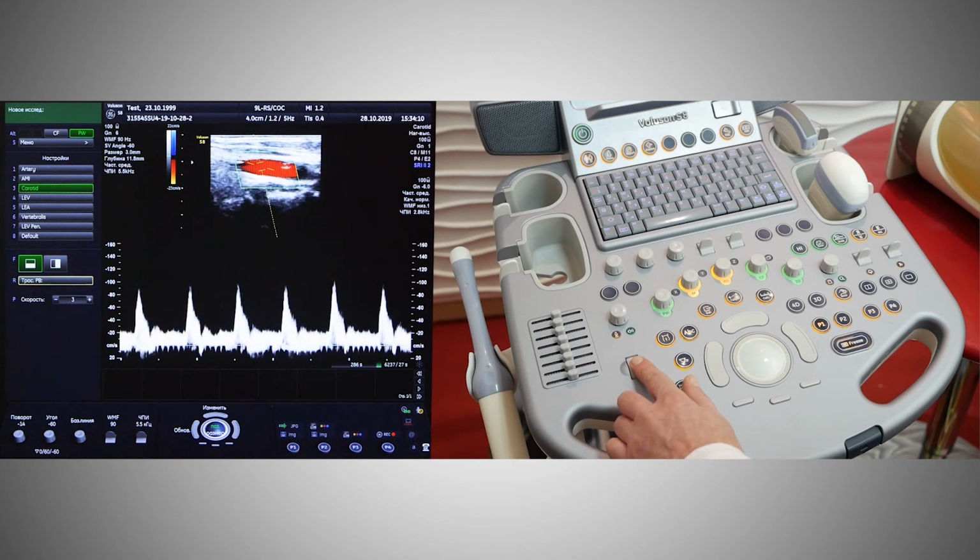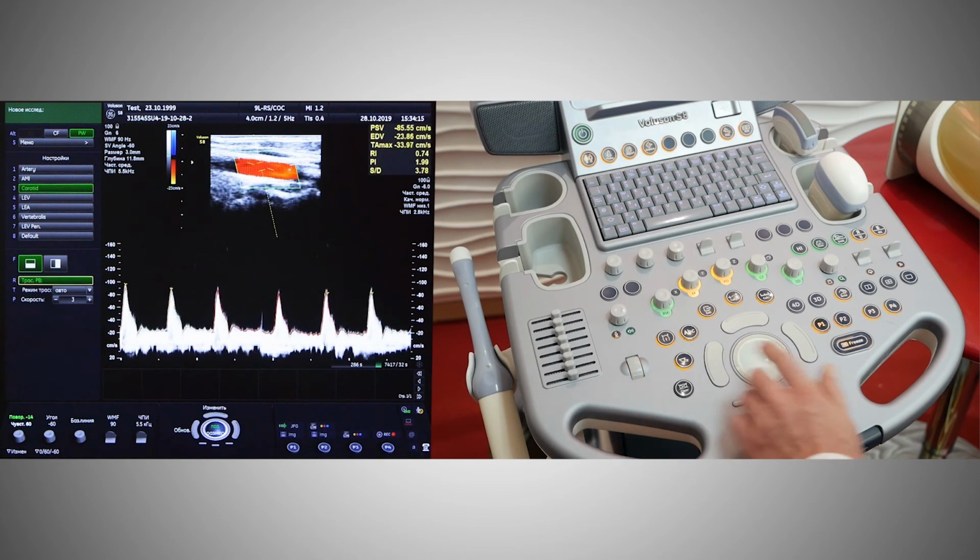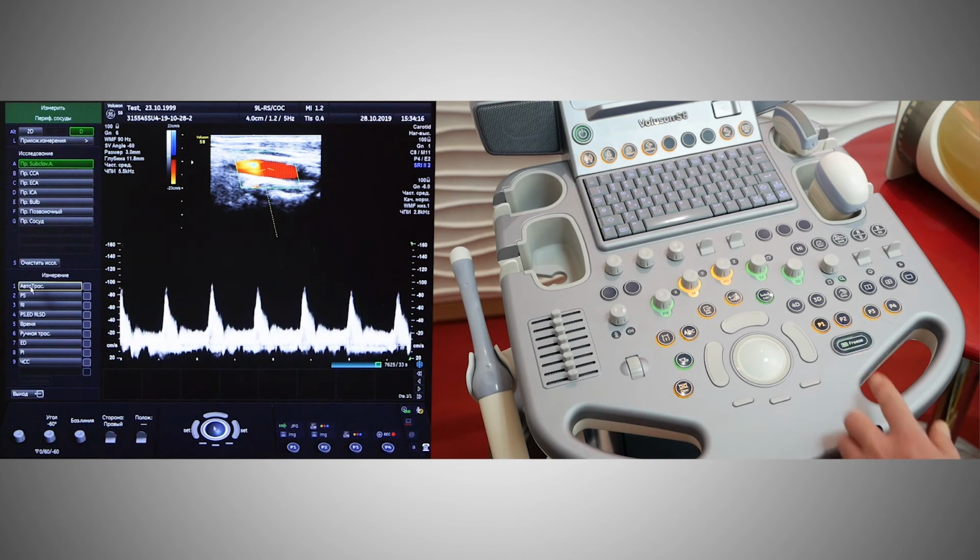When you click Trace on the left side of the screen, we turn on automatic tracing in online pulse wave Doppler mode. Let's do the procedure again.